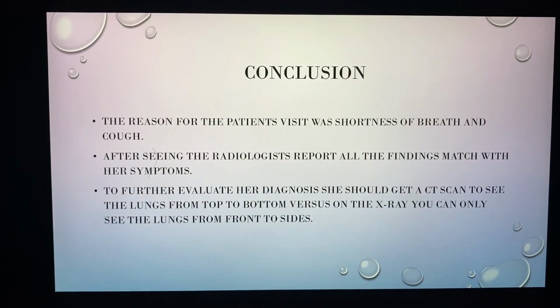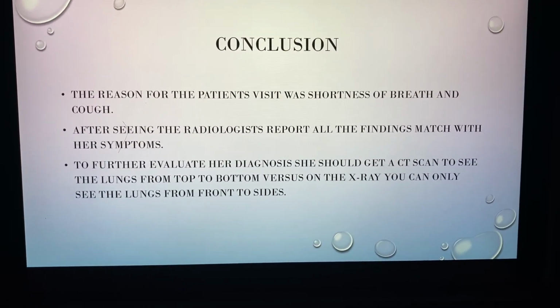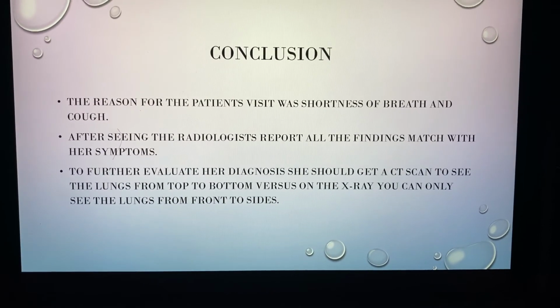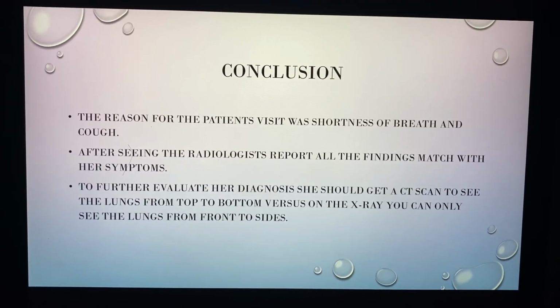So in conclusion, the reason for the patient's visit was shortness of breath and cough. After seeing the radiologist's report, all the findings match with her symptoms. To further evaluate her diagnosis, she should get a CT scan of the lungs from top to bottom, versus on the x-ray, where you can only see the lungs from front to the sides.